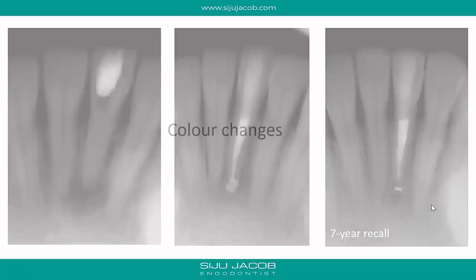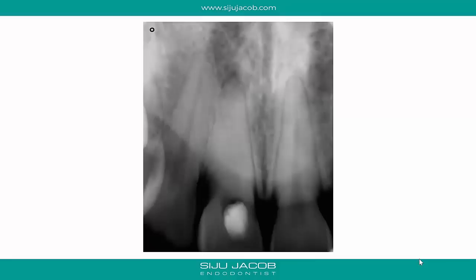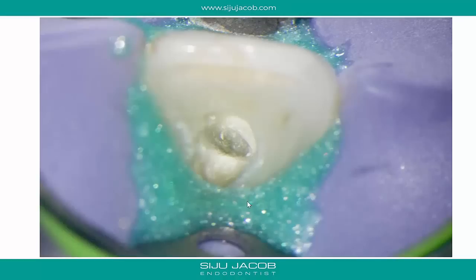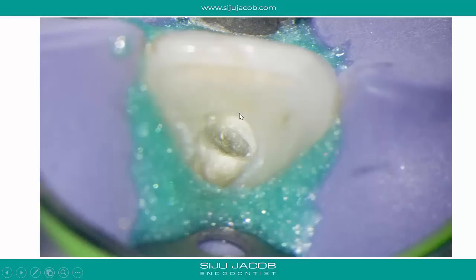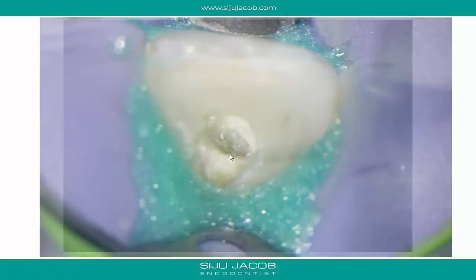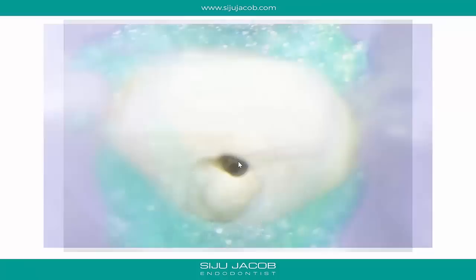The second technique for single-rooted teeth is color changes. When dealing with single-rooted teeth you often find different color variations — dentine will be white in color and the calcified portion of the pulp will usually be darker. You can see two different layers: a completely white part around the sides and a dark area in the middle — that used to be the pulp and is now calcified. We focus drilling only on this central dark area using a MUNSBUR, which is able to specifically drill where we want. That's exactly where we found the canal.